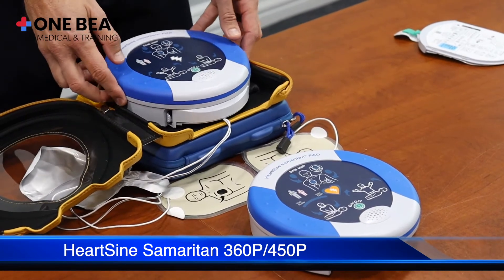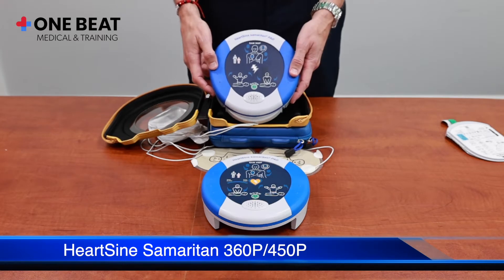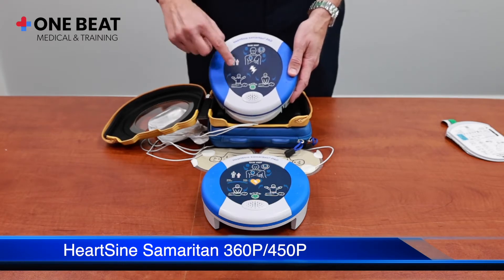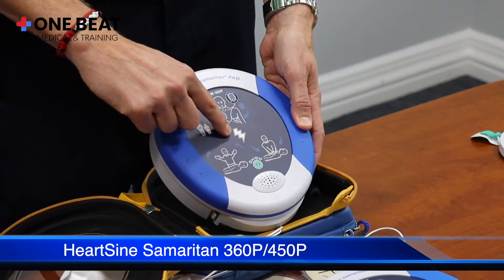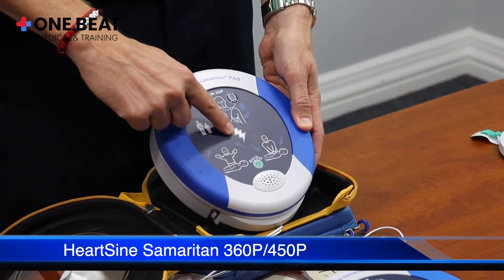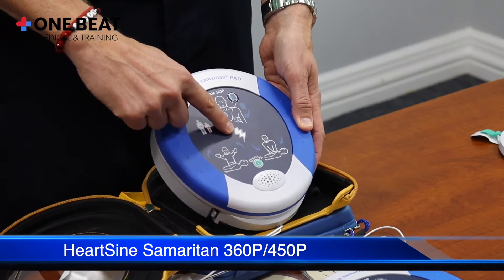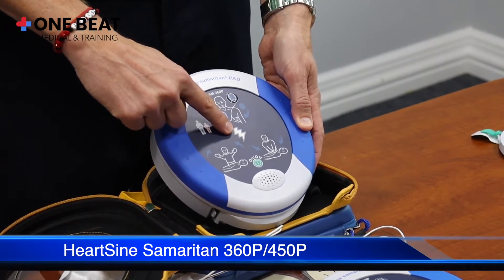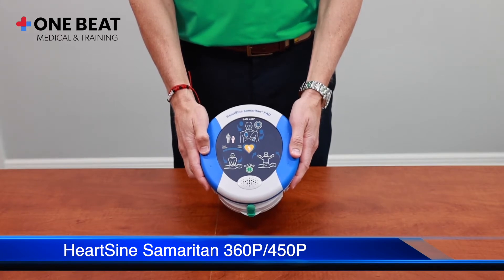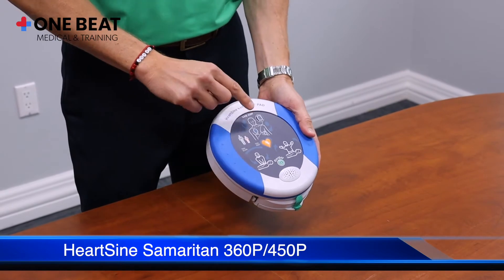We also have the HeartSine Samaritan 360p. This device is a fully automatic AED — you will notice there is no shock button. The lightning bolt symbol simply represents that it's fully automatic, and the device will deliver the shock if it determines a shock is needed.